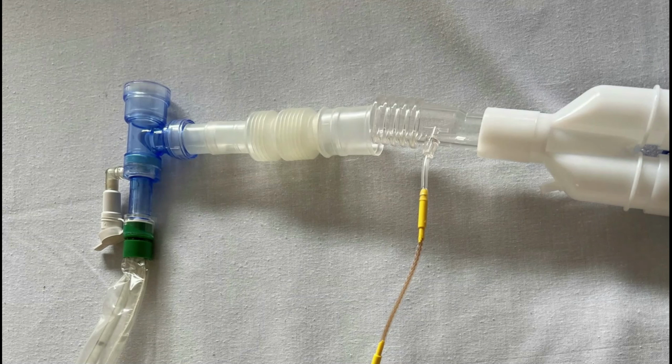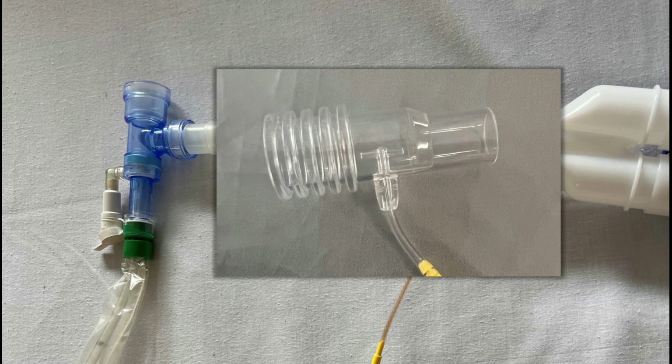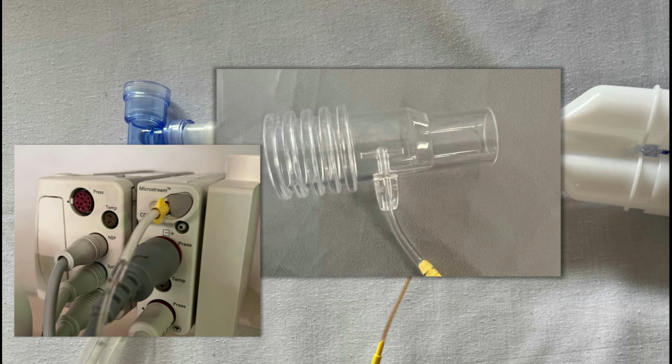Here are the components. The water separation filter connects between the Y or breathing system and the catheter mount. Then the tubing is connected to the CO2 module in the monitoring system. The yellow color of the tubing reflects that it can be used for several days. If you see orange tubing, that is for short-term use, less than 8 hours. The difference reflects the higher moisture tolerance of the extended use tubing.